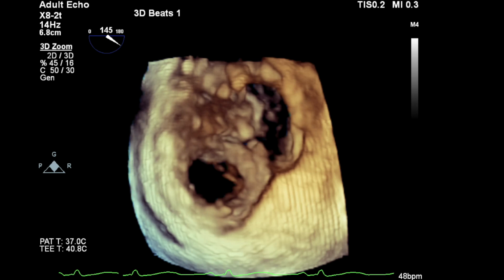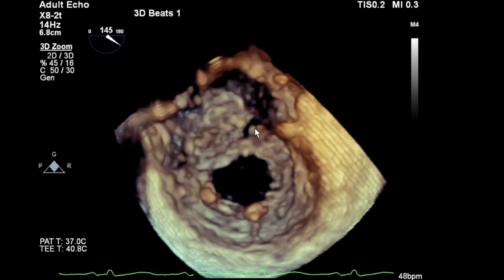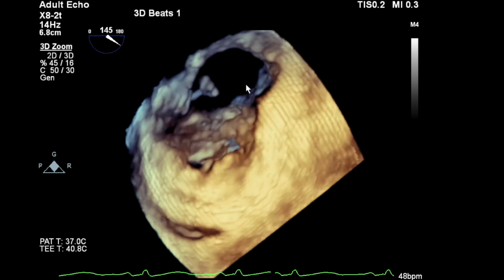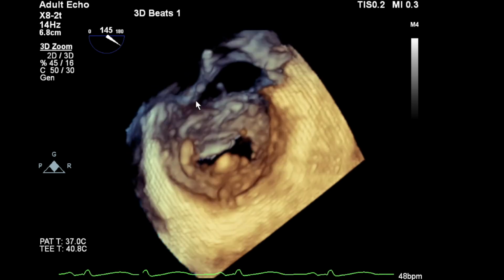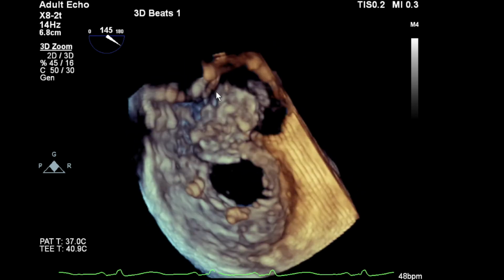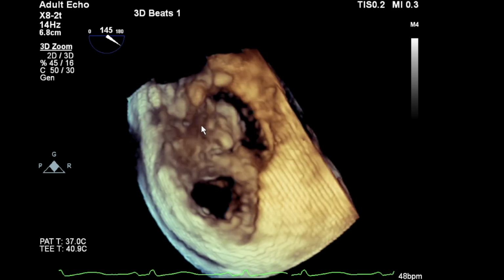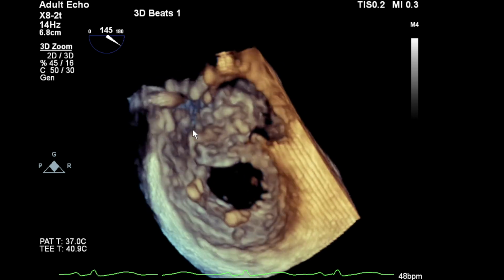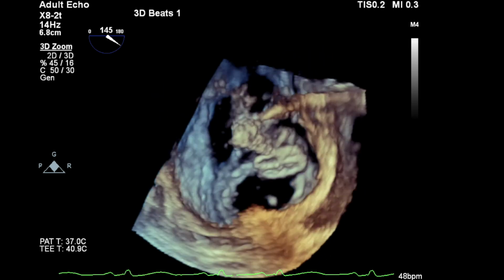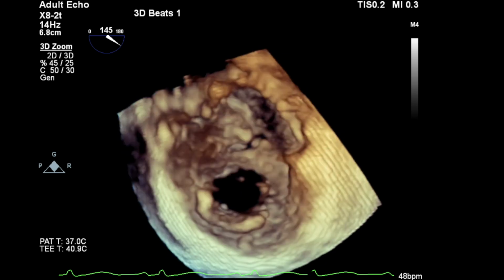So again, just to give you some landmarks first. So there's your mitral valve there. You've got your LVOT in the distance, which is just there. There's that region of tissue that had torn away from the aortic valve, just here. You can see that irregularity here, and you can see that this is the Occlutech device here, and I think I can see just tucked in sort of sideways there is the AVP 3. I'm just double checking. Yeah, it looks like that's it. Don't know if you can believe me when I say that. It's tough, isn't it? That's tough.